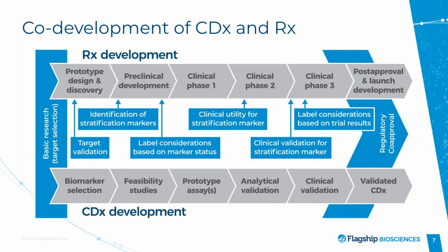And I should say this is another big jump, the LDT to the CDX. You're investing a lot more money in the assay, so you really want to be sure that you're ready to do it. But at the same time, it takes time to move from that research use only assay to an investigational use only assay that you can use in the registrational phase 3 trial. So you do have to be planning ahead, and it does come down to how much money you want to spend up front, and how aggressive you want to be on it.